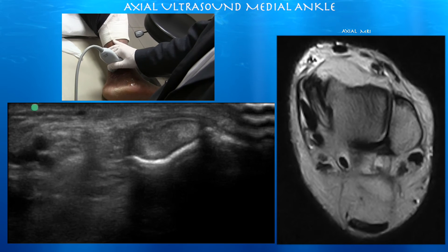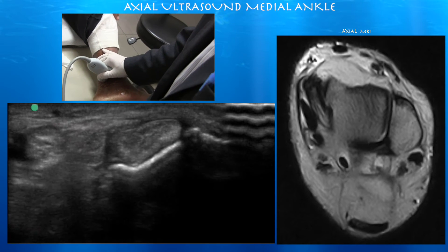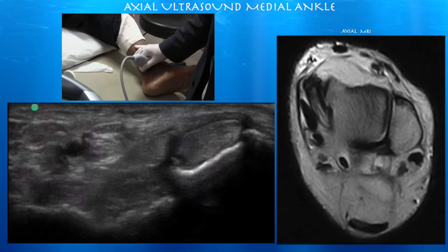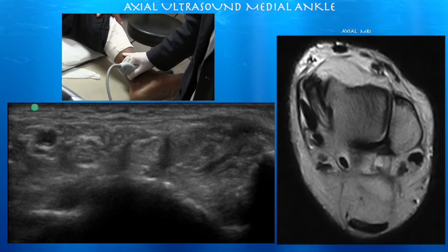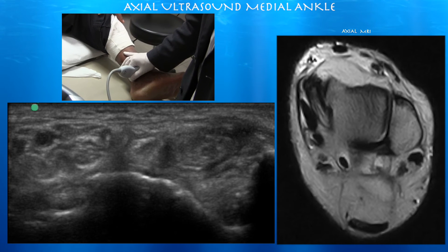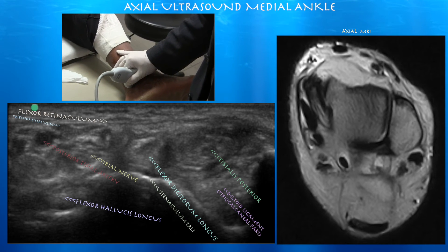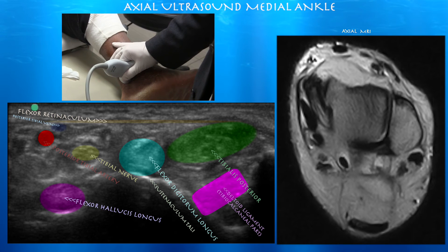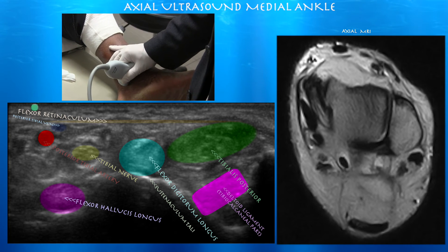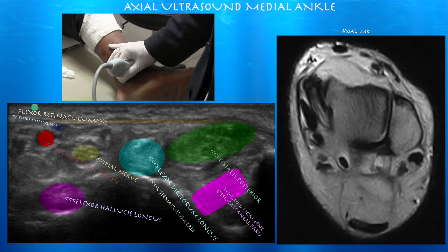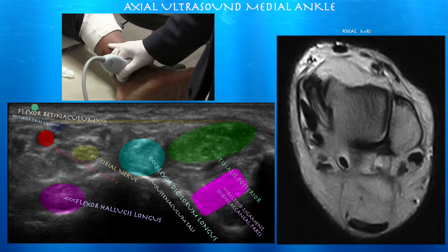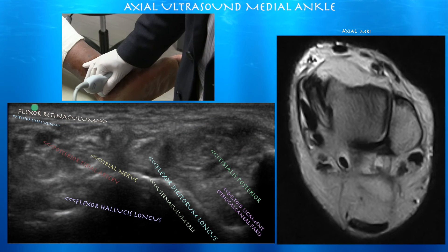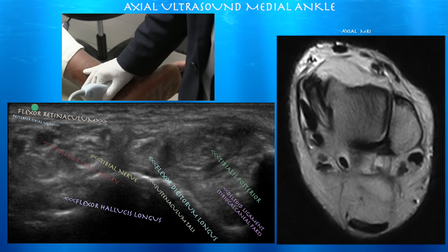Usually the tibialis posterior tendon is about twice as big as the flexor digitorum longus tendon, but you can see that it's kind of elongated and irregular. There may be some intrasubstance tearing, I suspect, based on this ultrasound. You can also see the deltoid ligament — the tibiocalcaneal part — underneath the tibialis posterior tendon.